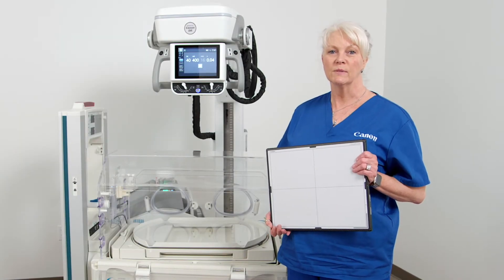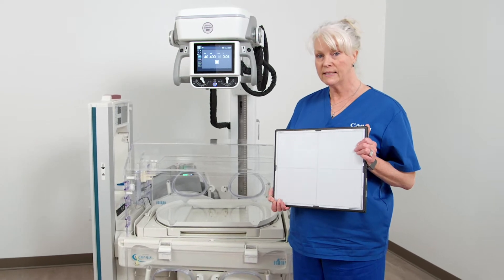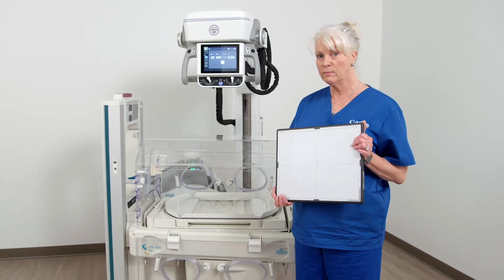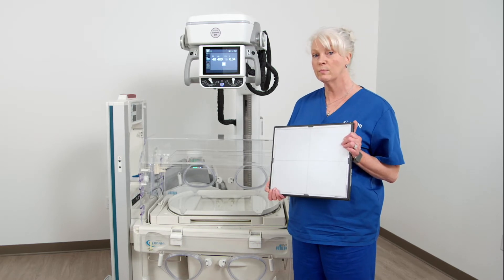Hi, I'm Thea with Canon Medical Systems. We get a lot of questions about whether or not our 810C, which is an 11 by 14 panel, will fit properly into the incubation tray for pediatrics.